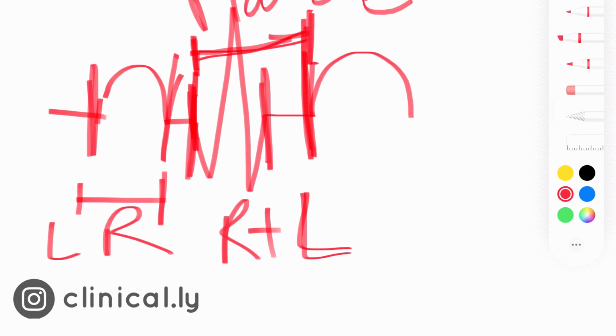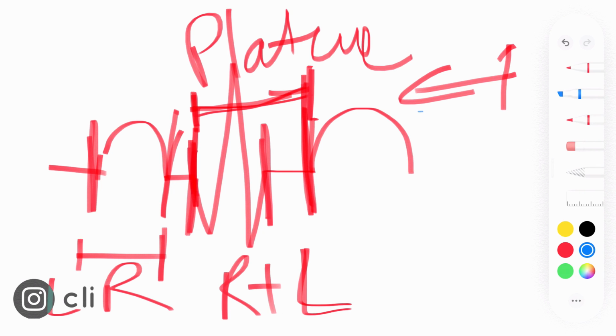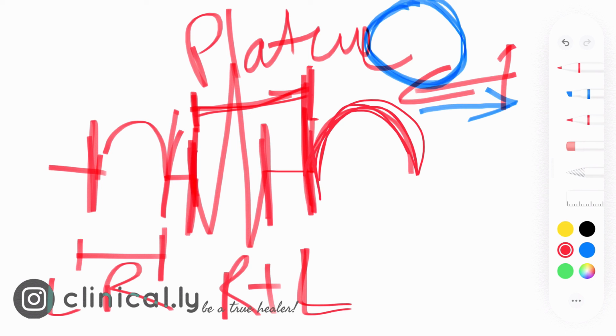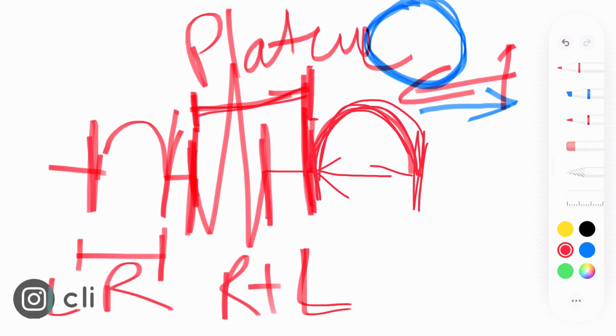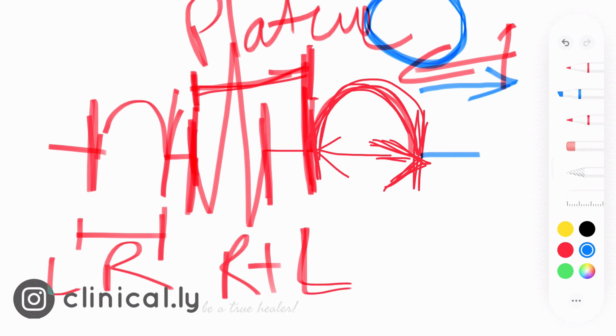And once their plateau phase ends, they start to repolarize. They repolarize in a fashion from epicardium towards the endocardium, which is essentially depolarization going from endocardium towards the epicardium, which we have seen from a directional vectorial point of view is coming towards the recording electrodes, and it gets recorded in the positive smooth shape waveform. And the duration of the T wave is the duration required for the entire ventricular cardiomyocytes to go from a depolarized plateau phase to the repolarized state. This is recorded here, and once this is recorded, then the isoelectric baseline remains.